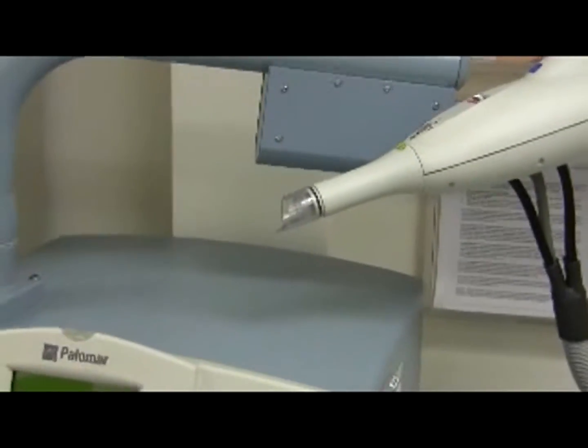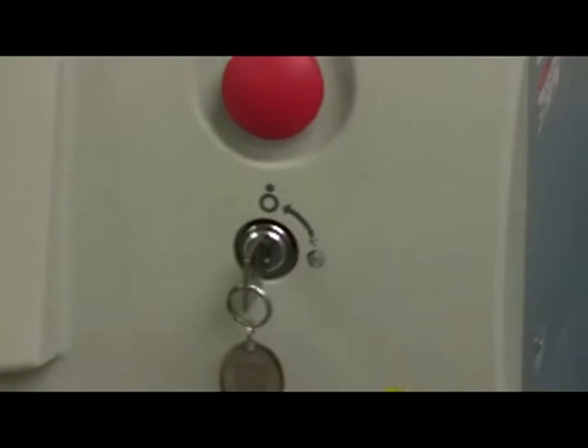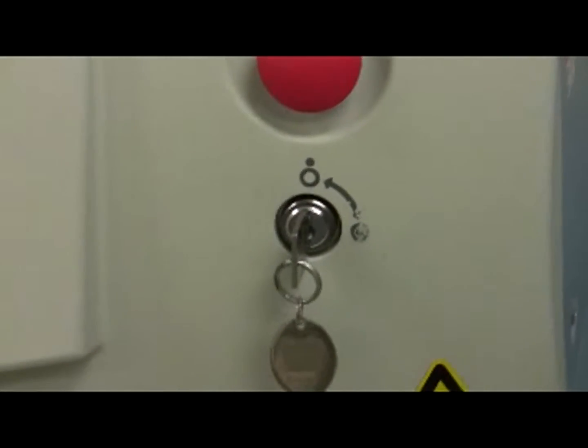Find the laser with the key turned to the dot outside the circle. We can see the key is turned with the dot outside the circle — that's correct. If the laser has been turned off via the power switch at the back of the console, turn that switch to the on position first.